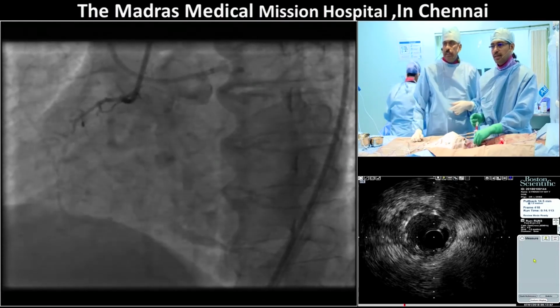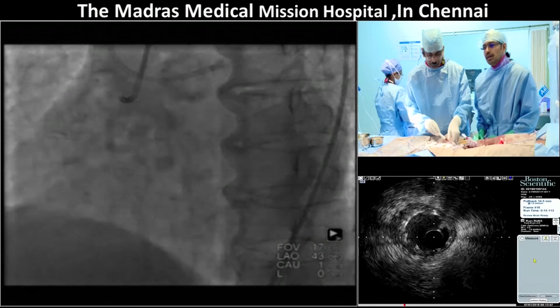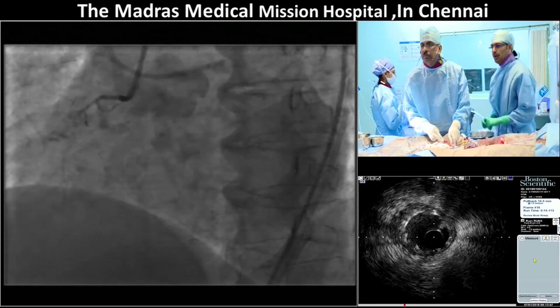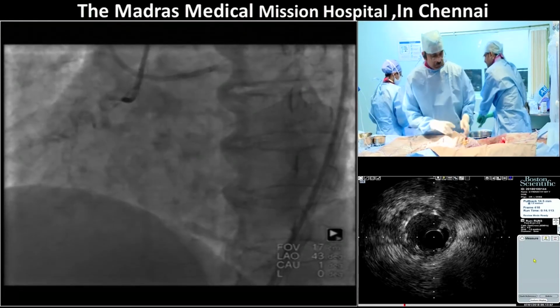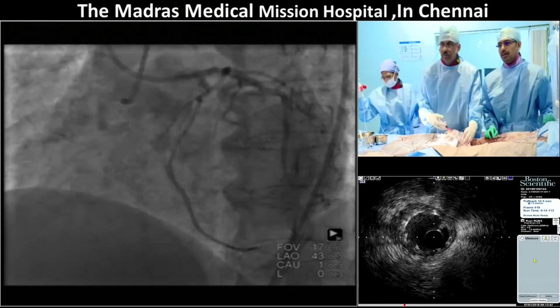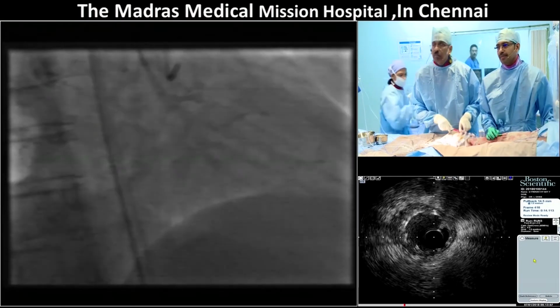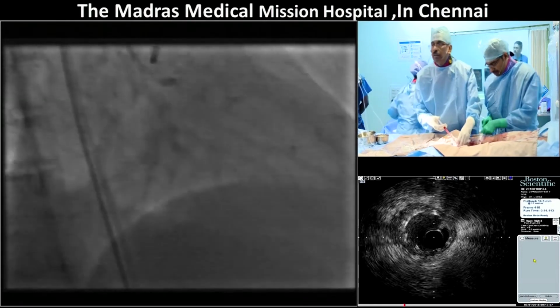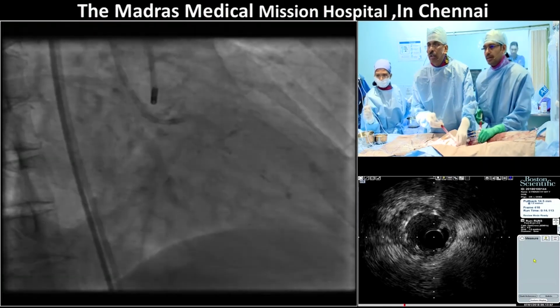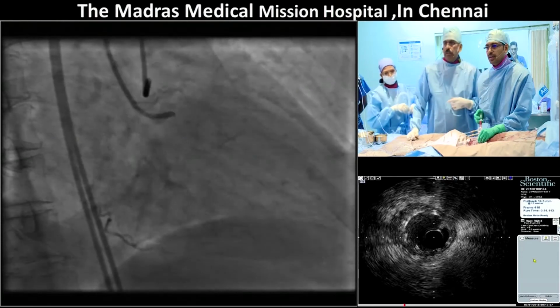So you can see that it's a short segment. Yeah, it is a short segment, nearly about 15 to 18 millimeters. So go to an RAO. Only problem is that there is an RV branch coming in the distal cap, and the occlusion is in a bend. The actual occlusion point is in a bend, about 30 to 40 degree angle. Yeah. So again, we are taking now an RAO, same strategy. I take the shot first and Vijay continues the shot after that.